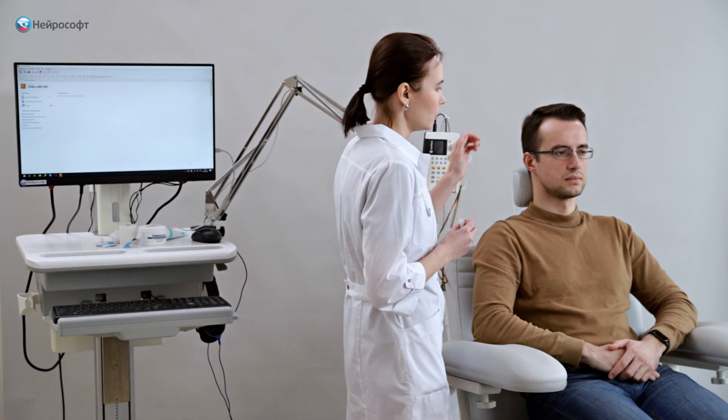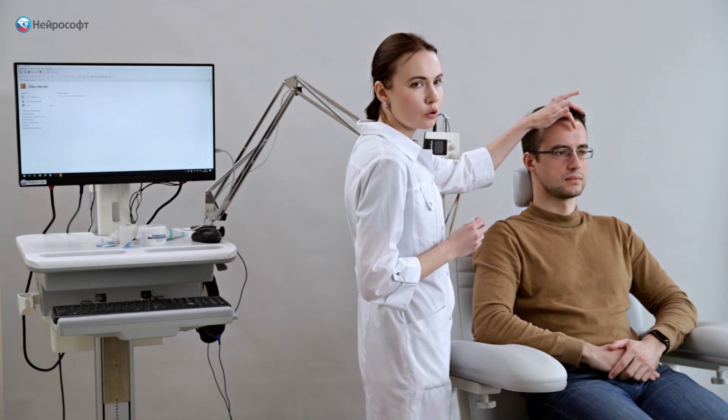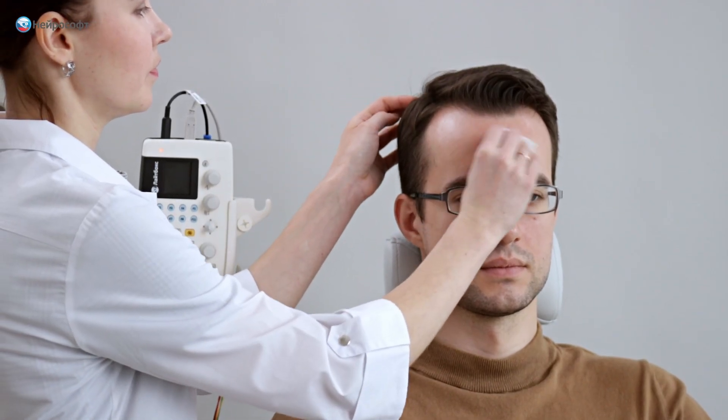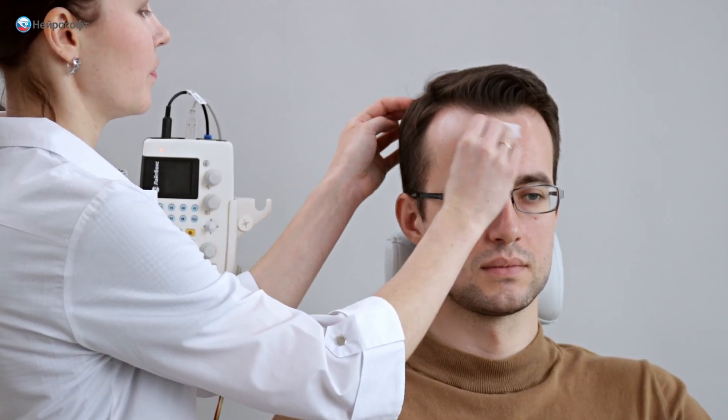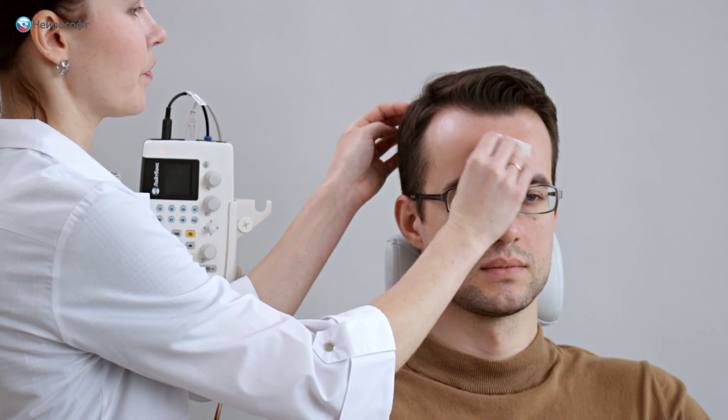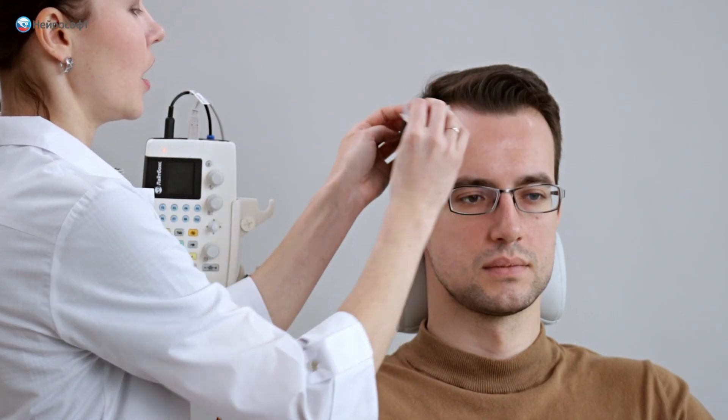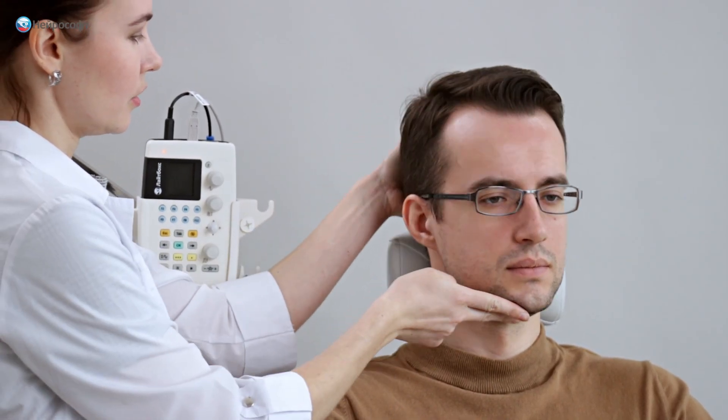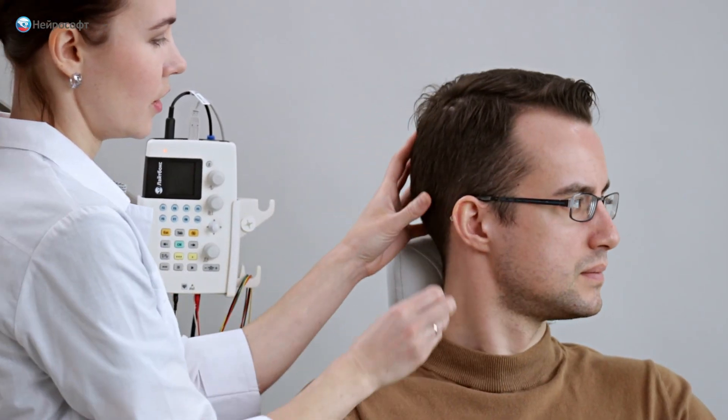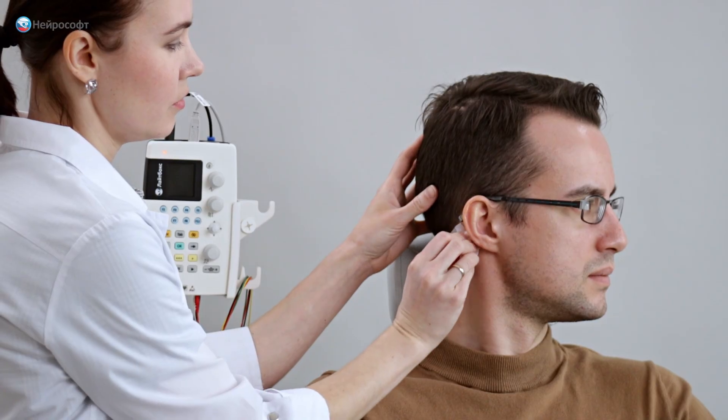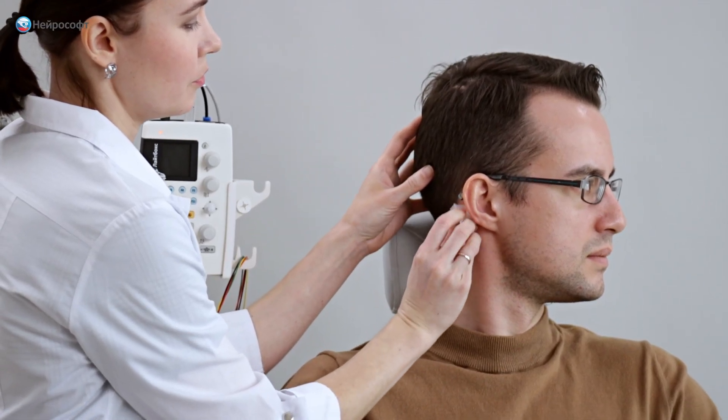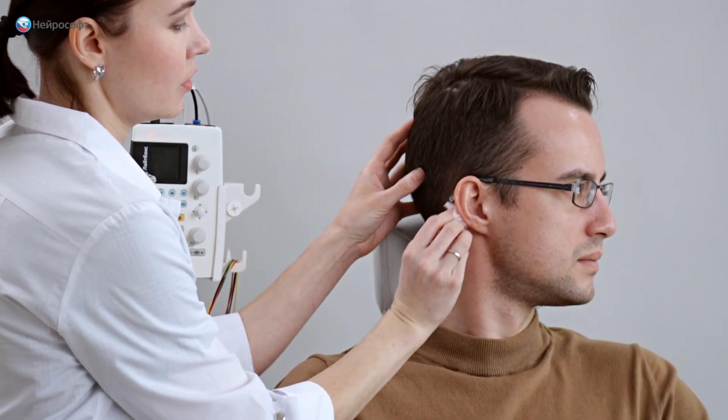The ground electrode will be placed on the patient's forehead. The active electrodes will be placed on the mastoids. We degreased the skin of the mastoids on both sides.